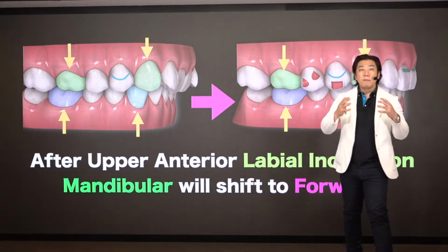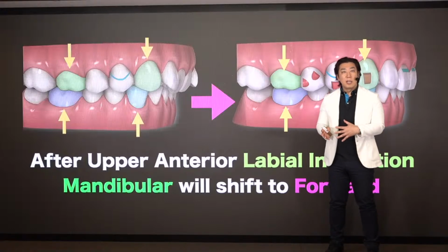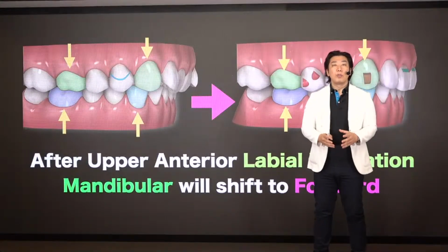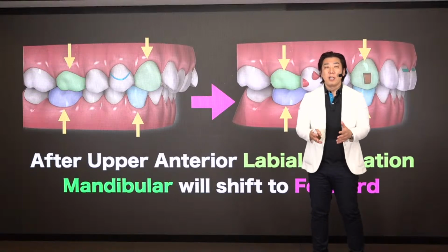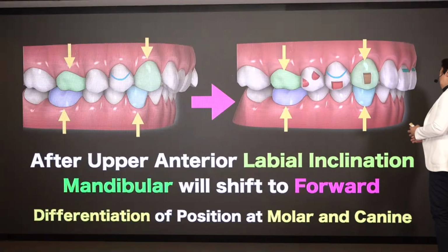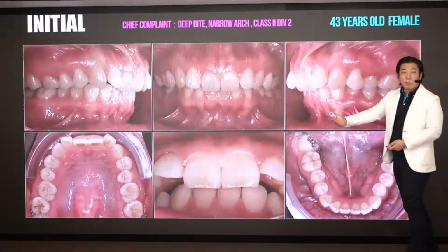We have to think about the function analysis first. If function is a problem, the first approach is not simulation only. A very important thing is that the patient is a human, not a simulation, right? Then the differentiation of the position of molar and canine is totally different. Then we have to check more precisely.